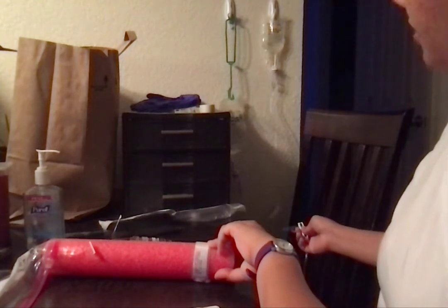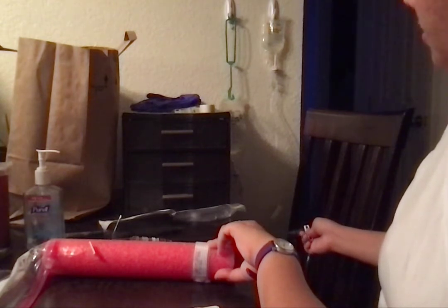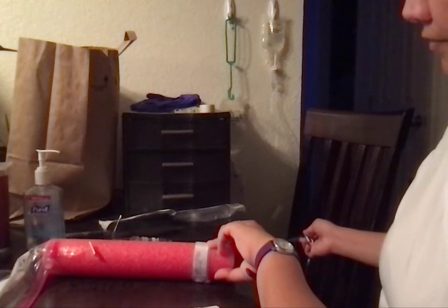Okay. Down this touch. Okay. I think that's about 2 drops per 5 seconds.